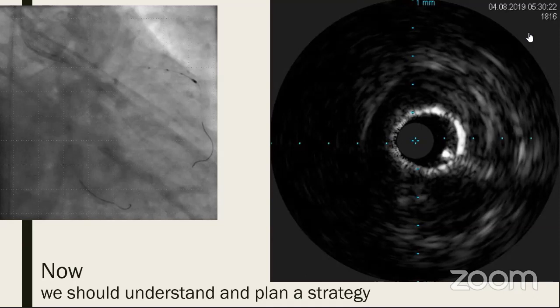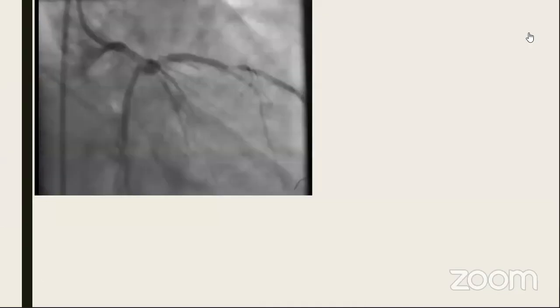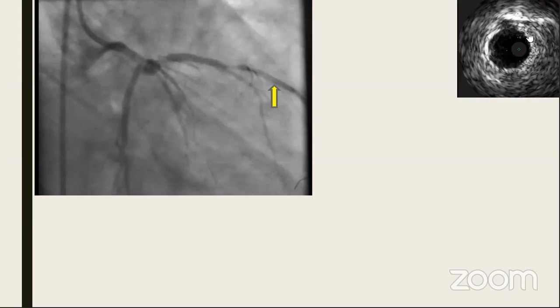apparently from the angiography, it was related to either the rami or the circumflex. However, the IVUS shows unequivocally that it is related to the LAD, and the LAD shrinks into the normal caliber before the wire of the circumflex gets into the view. Accordingly, this was the relatively healthy landing zone that we considered.